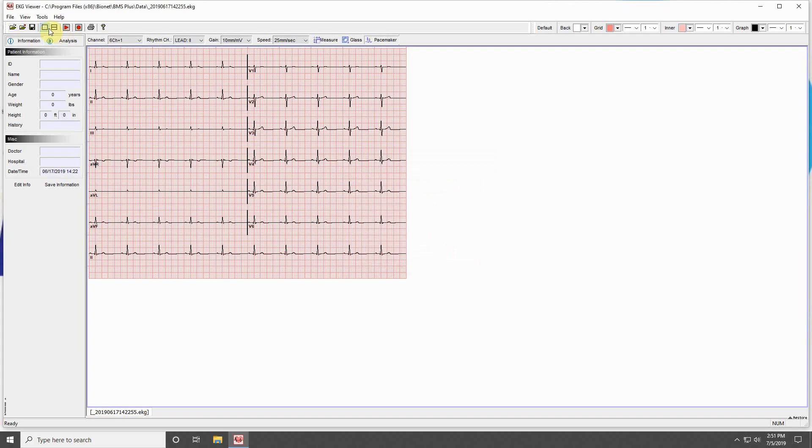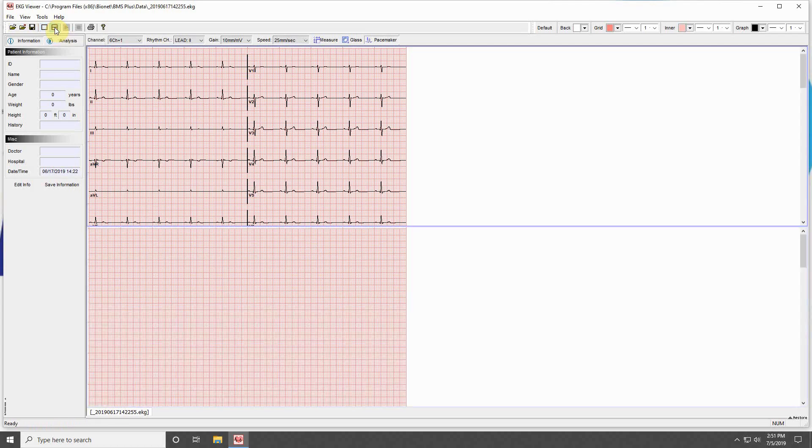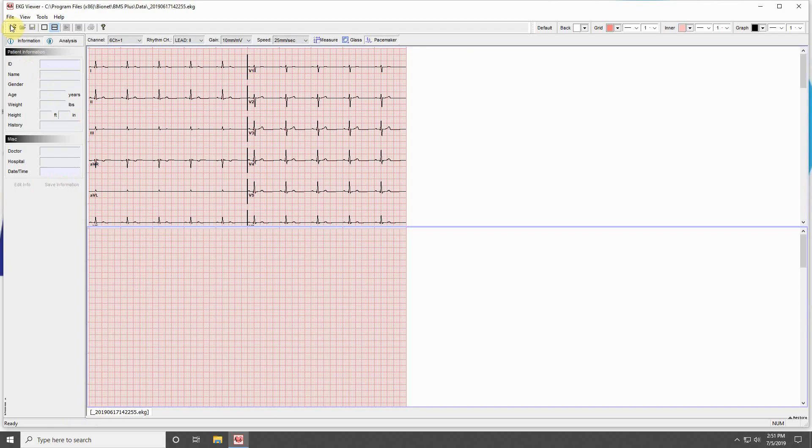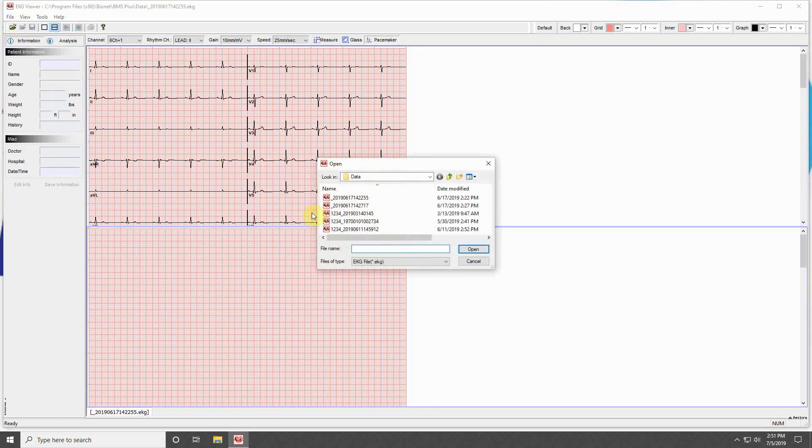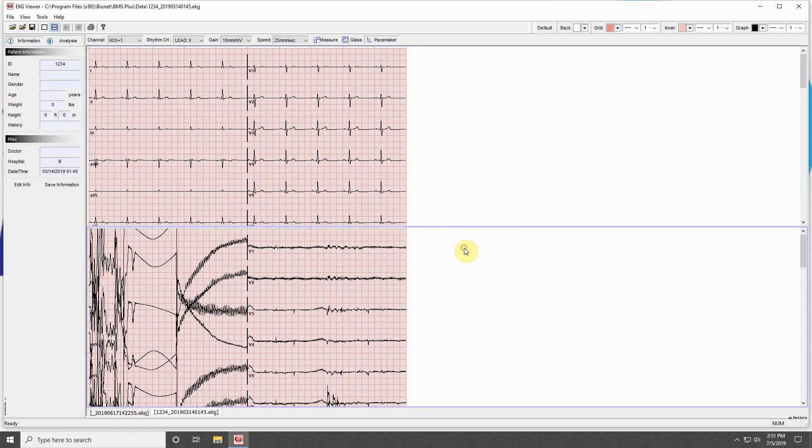The next buttons allow you to switch between one window and two window modes. Two-window mode is useful for comparing two ECGs. Click on the bottom window and open a separate file to compare the two ECGs. Click One-Window Mode to return to your original view.